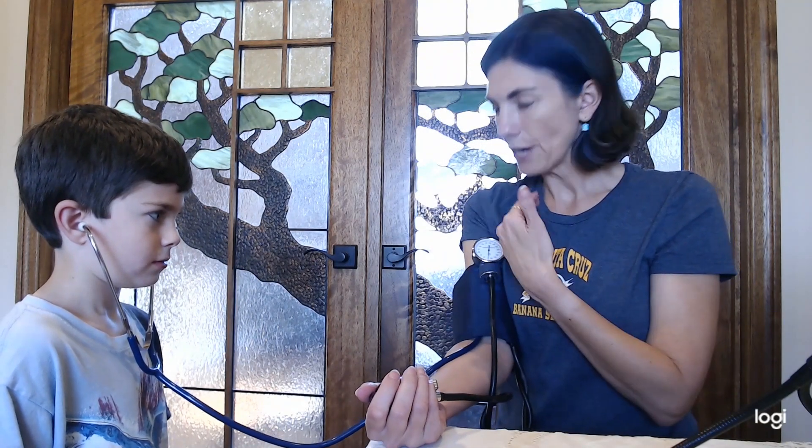What I'm going to do, Owen, is I'm going to increase the pressure and you're not going to hear anything, and then I'm going to start letting the pressure out and you're going to start to hear a clicking sound. You need to look at the number when you first hear the clicking sound, and then when the clicking sound goes away you have to look at the number for that too. Okay, ready?